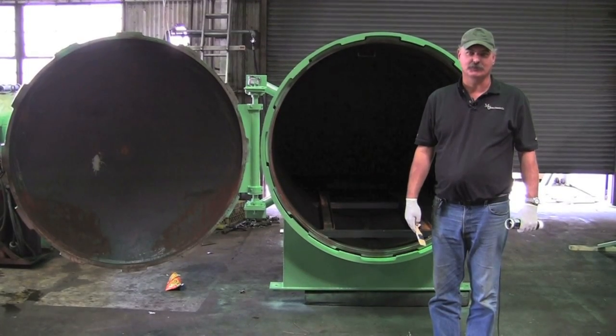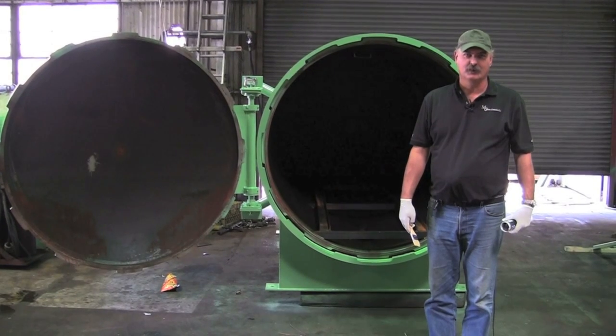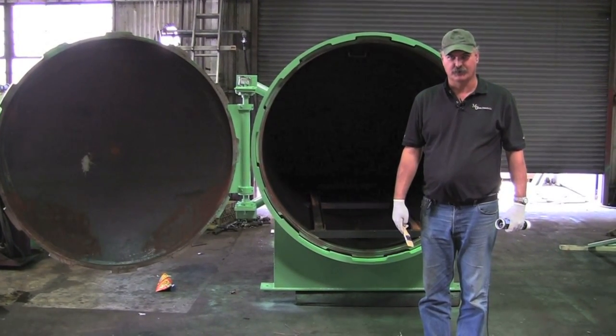Hi, I'm Cory from the Mark Costello Company, the service manager. Today I'm going to show you how to grease the doors on our sterilizer.